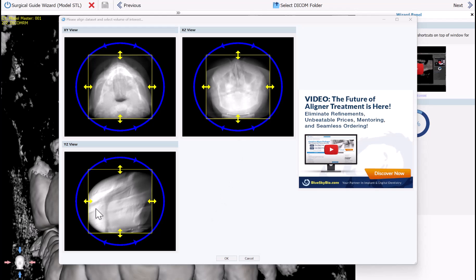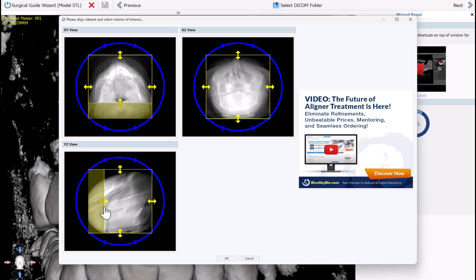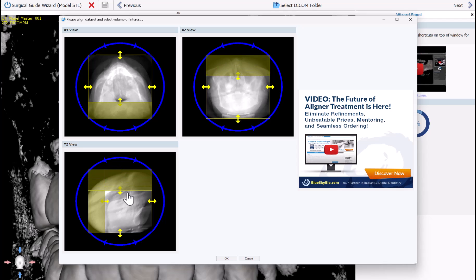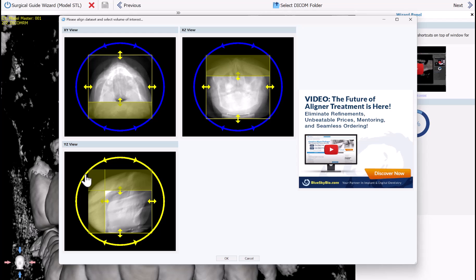On the screen that comes up, you can grab and drag using your left mouse button any of the yellow borders to define the relevant field of view. The area that is selected will be magnified within the software so you can see it accordingly, and it will remove any unnecessary data to lower the processing load on your computer.